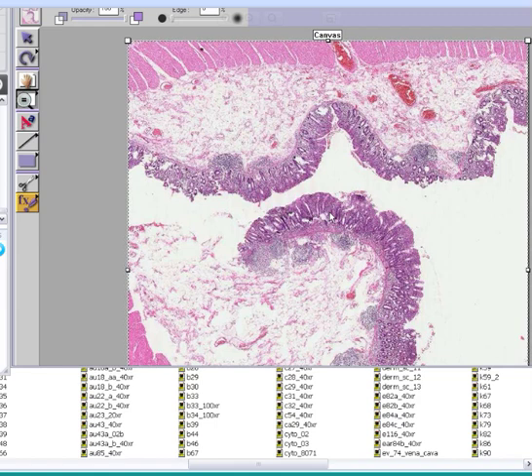So, ladies and gentlemen, I want to tell you exactly what we're looking at because I know you're on your toes right now with bated anticipation. This is the most classical case of chronic ulcerative colitis you'll ever see. In other words, it is one of the main types of primary inflammatory bowel disease. Remember, we spent a lot of time on it.